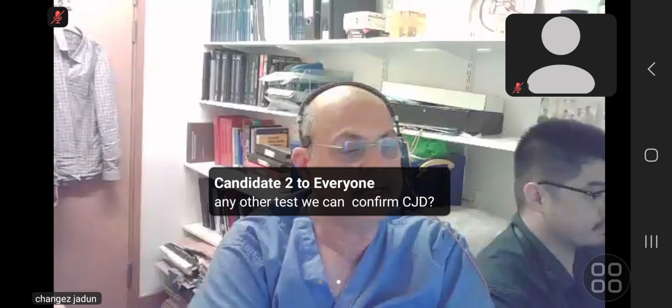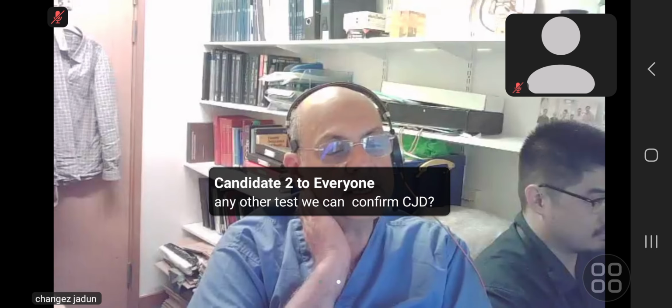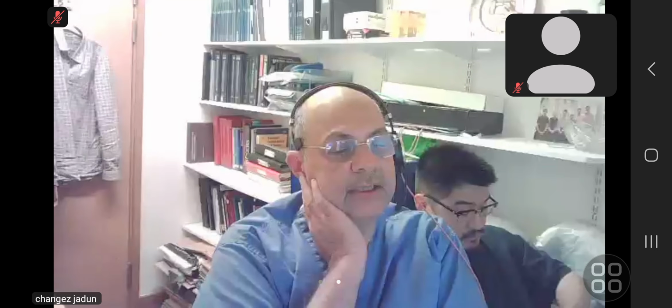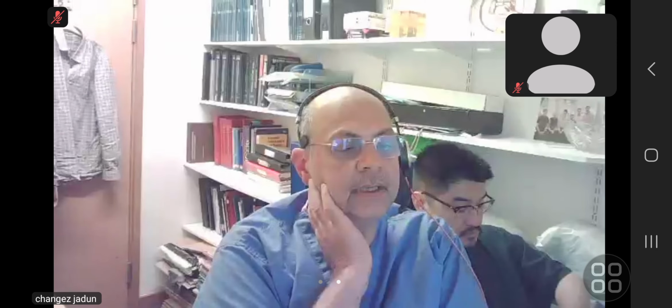How to differentiate between spinal cord ependymoma and cavernoma, as both have a hemosiderin rim? The cavernoma will have a complete hemosiderin rim. Number two, it will be small. Number three, it is usually paracentral. Ependymomas are usually in the center of the cord and have a cystic component. They have bigger cord expansion as well, and enhancement is avid as well. So that's how you differentiate.